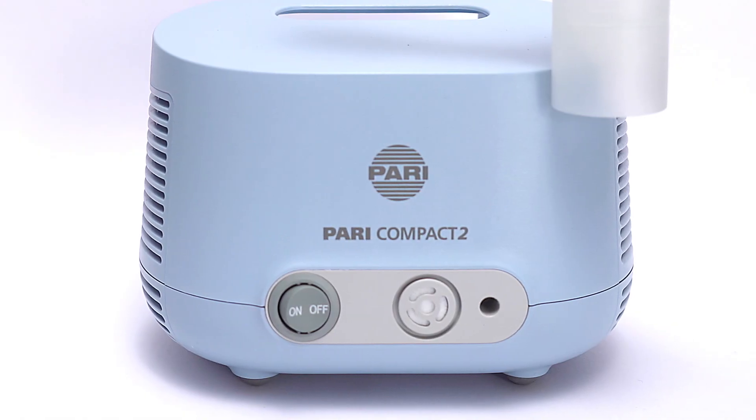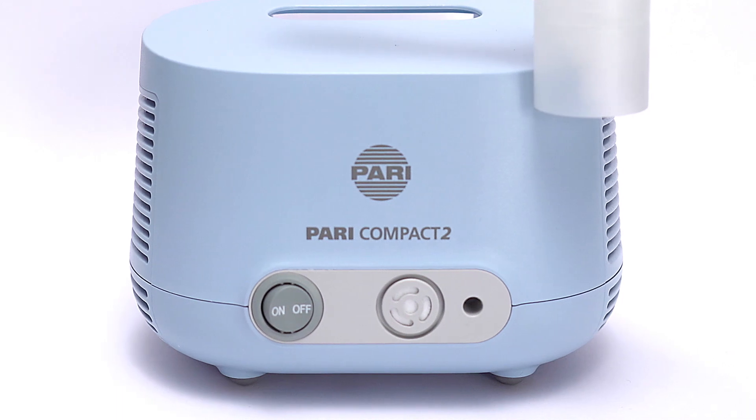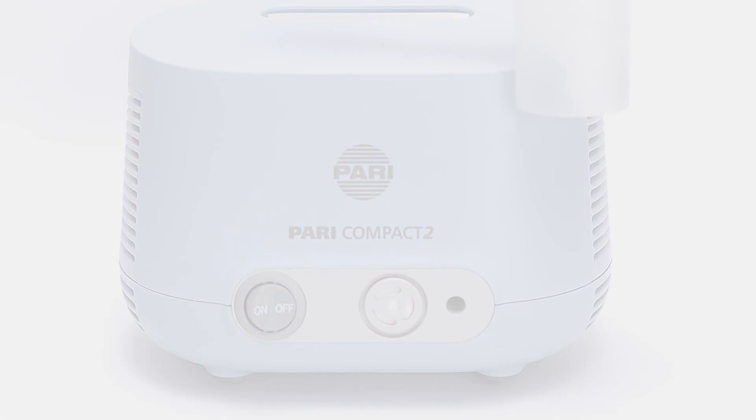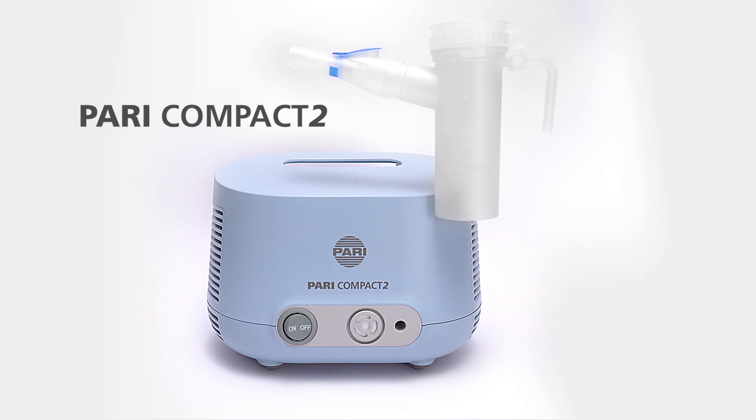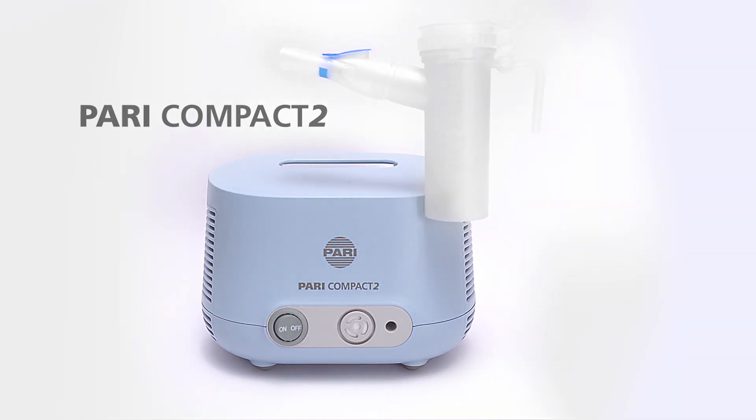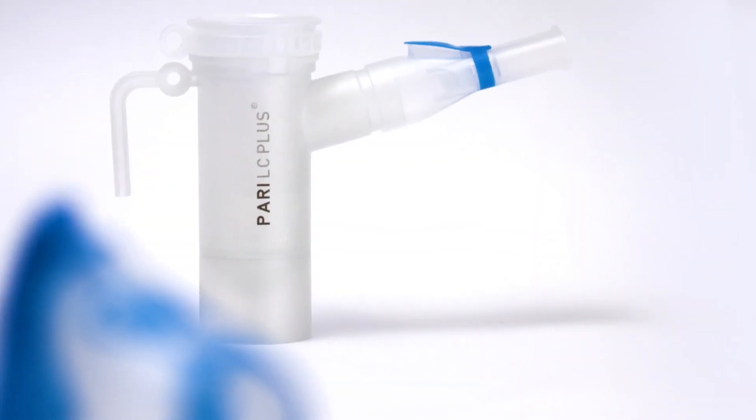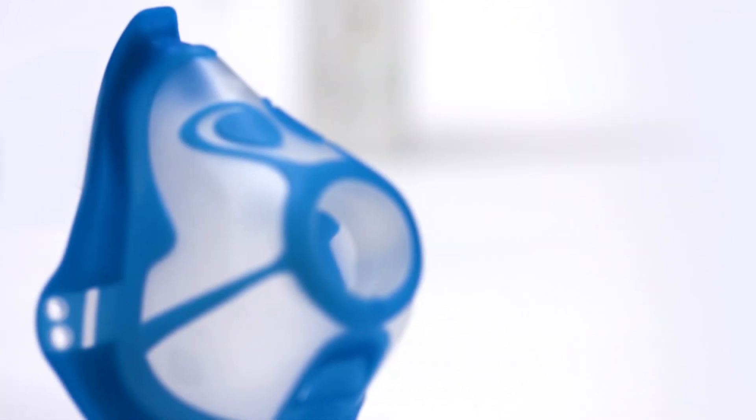PARI Compact 2 is an inhalation device for adults and children aged four years and older for the treatment of diseases of the lower airways. It's equipped with a PARI LC Plus nebulizer and a PARI Child Mask.